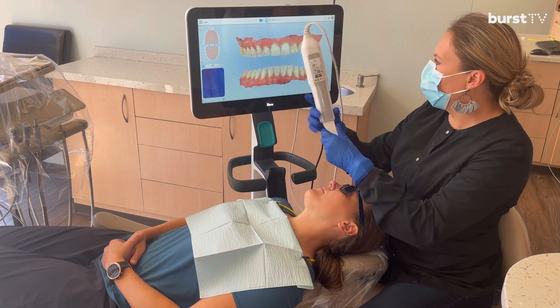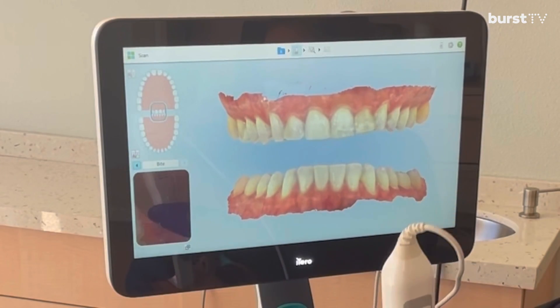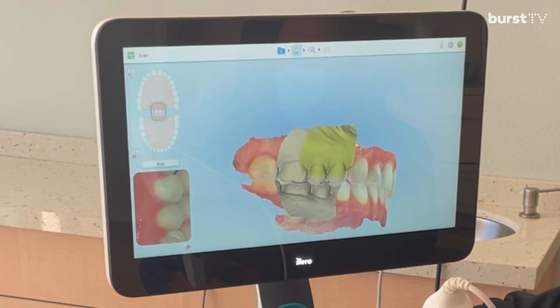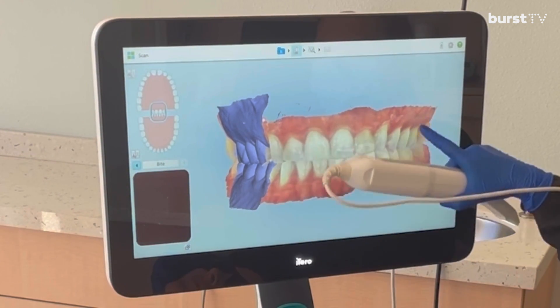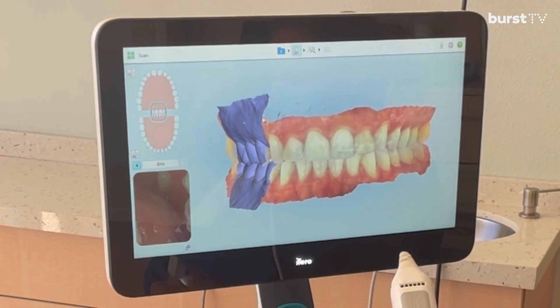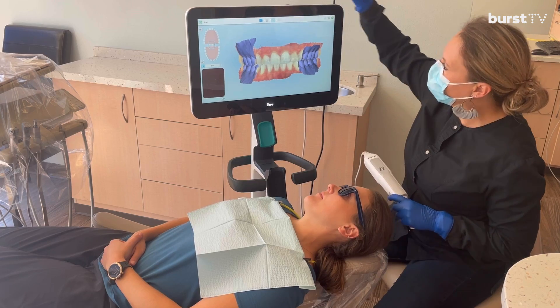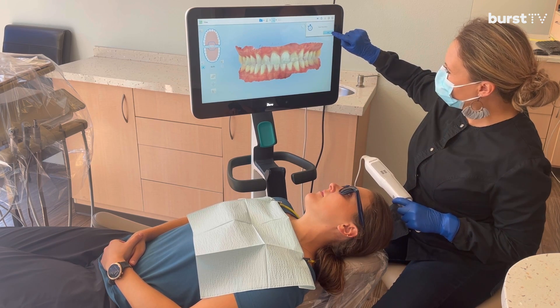The very last thing we need to do is check the bite. Go ahead and open. I slide this in — go ahead and close, bite down on your back teeth — and then I do a zigzag motion up and down. And there we have it. You always want to start canine to the first molar. If you go ahead of the canine, the scan gets confused. Go ahead and close. Good. Starting at the canine — and just look, there we go. That is our scan.